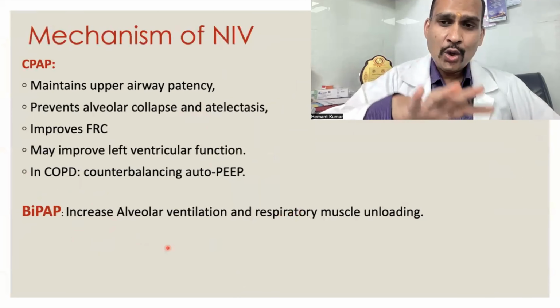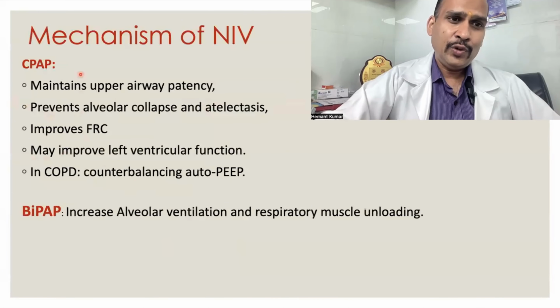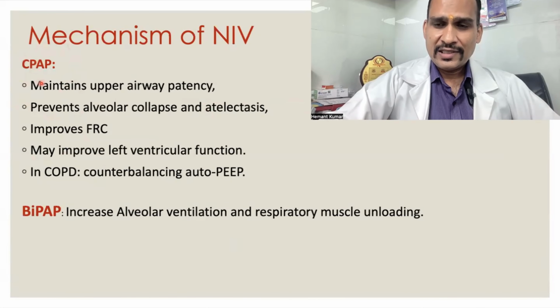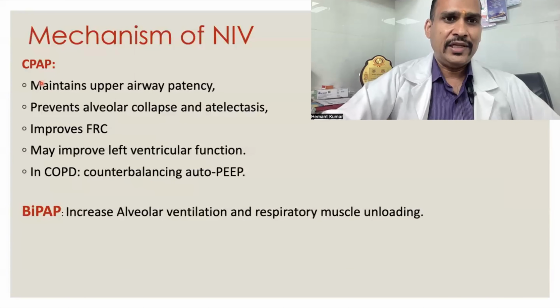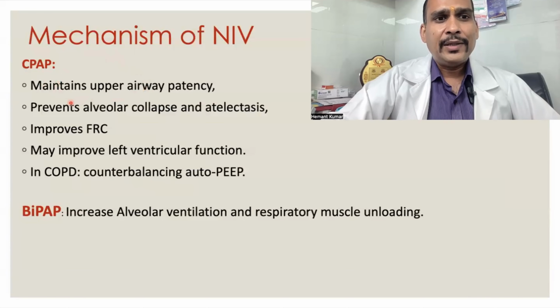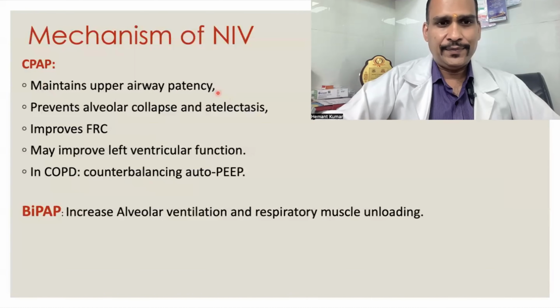So how does NIV help this type of patient? If you apply CPAP, meaning constant pressure during inspiration and expiration, it helps maintain upper airway patency. Those patients who have obstructive sleep apnea, it will help.